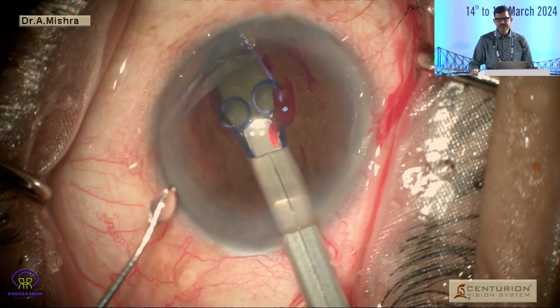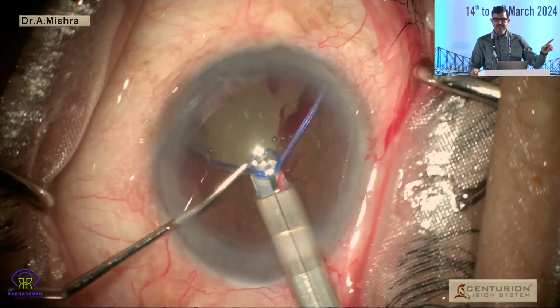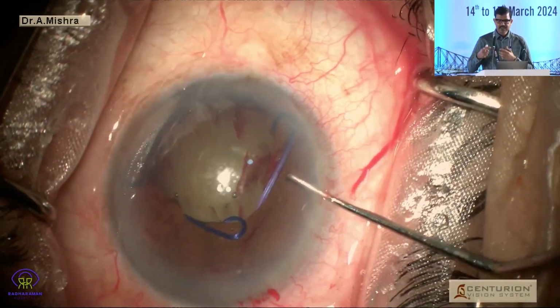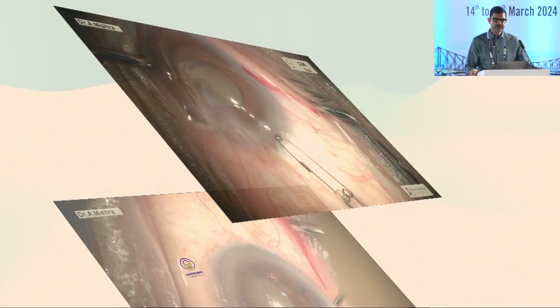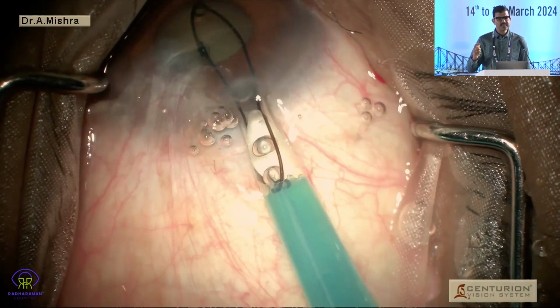The technique of injecting it is that the distal scroll should be engaged first at the distal side. If the side scrolls are engaged simultaneously while the ring is being engaged, it is fantastic, because then you have only one scroll left, which you can engage from the other side. And then after all the scrolls have been engaged, it has got an 8-point fixation, a fantastic device indeed. And once they're all engaged, you can reshape the pupil and bring it back to the central point for your convenience. The Gupta's ring is an Indian counterpart of similar design.